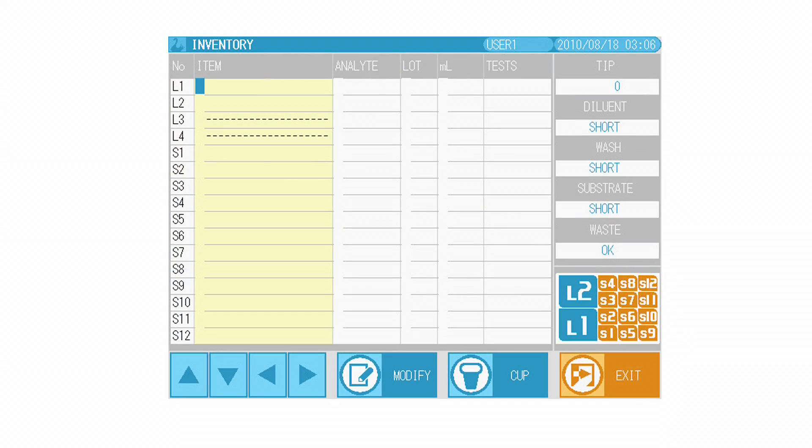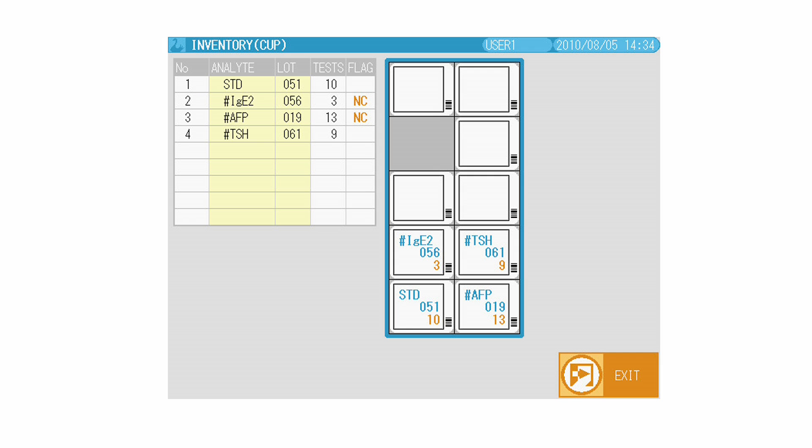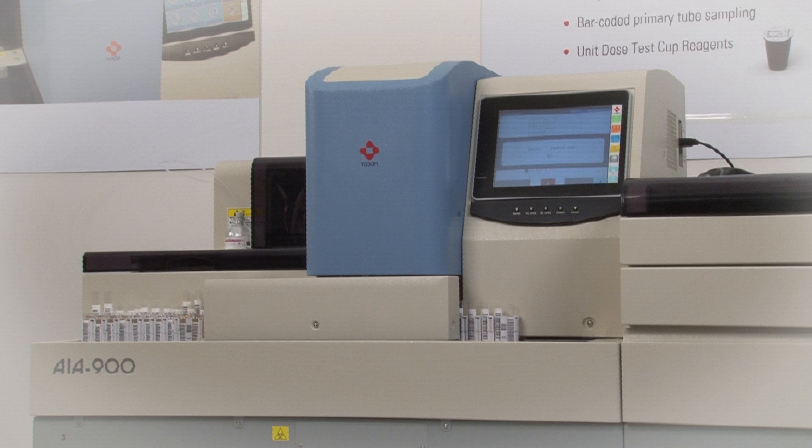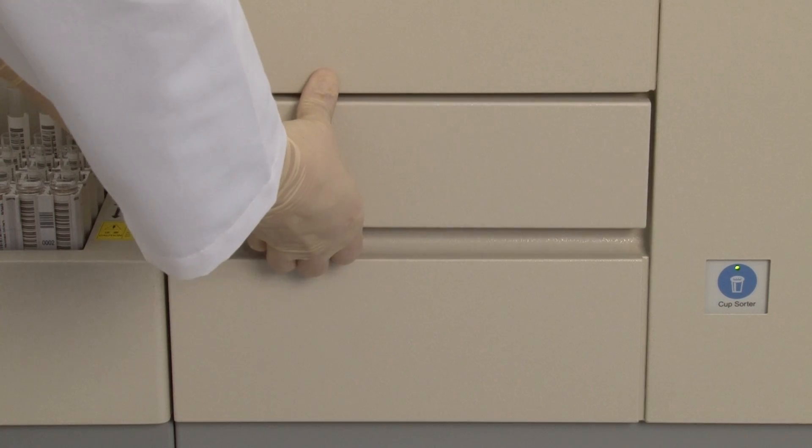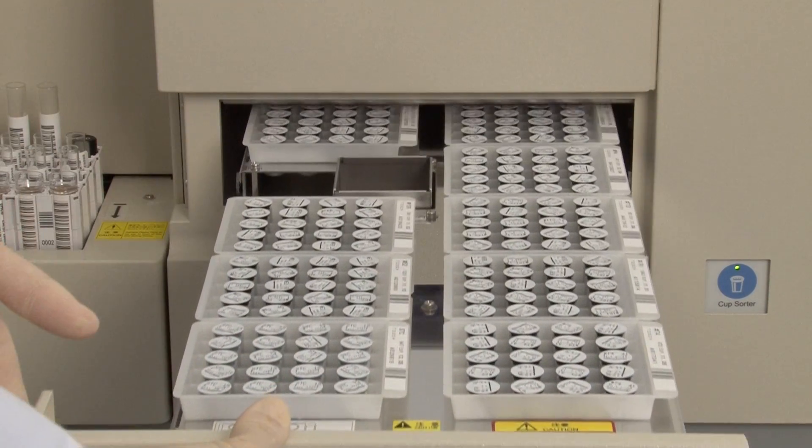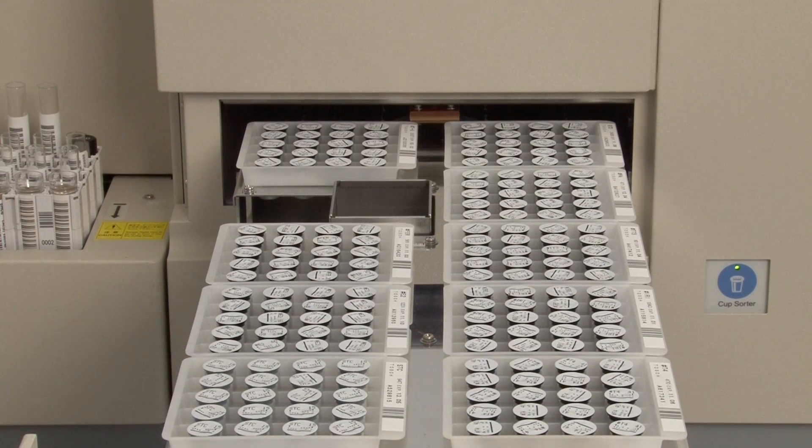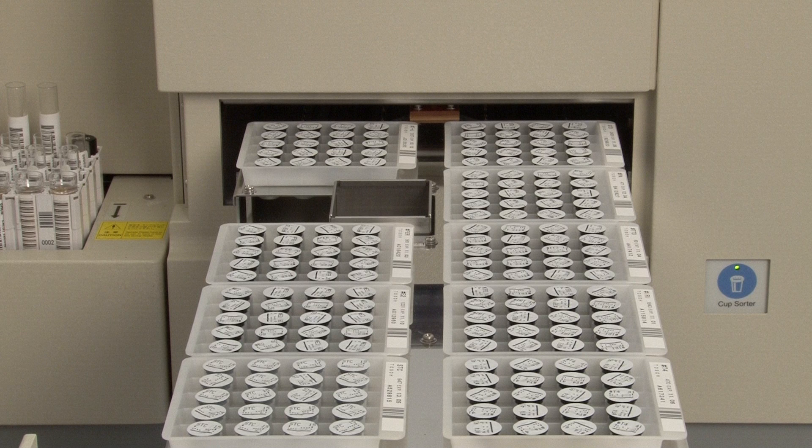Color coding on the reagent inventory screen indicates whether or not the lot number on board is calibrated. If workload increases or more automation is desired, the reagent tray sorter can be added at any time without having to perform additional method validations.